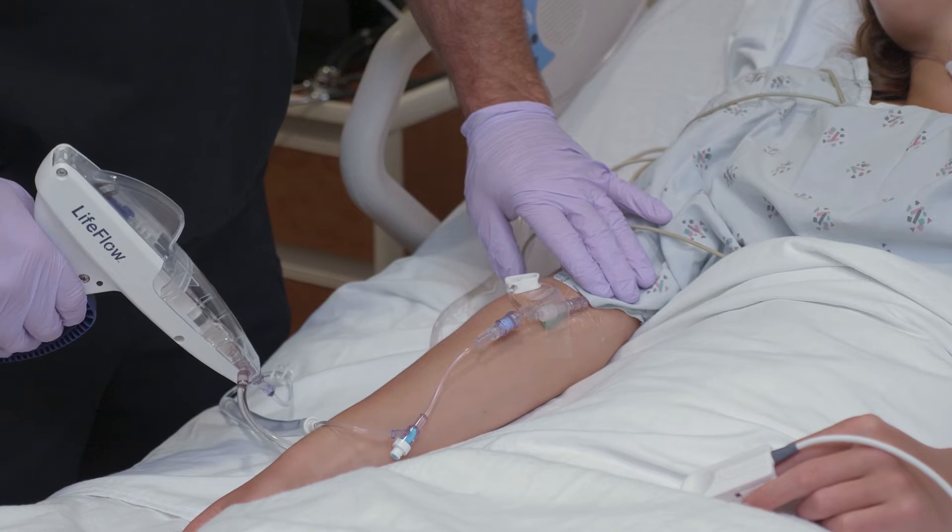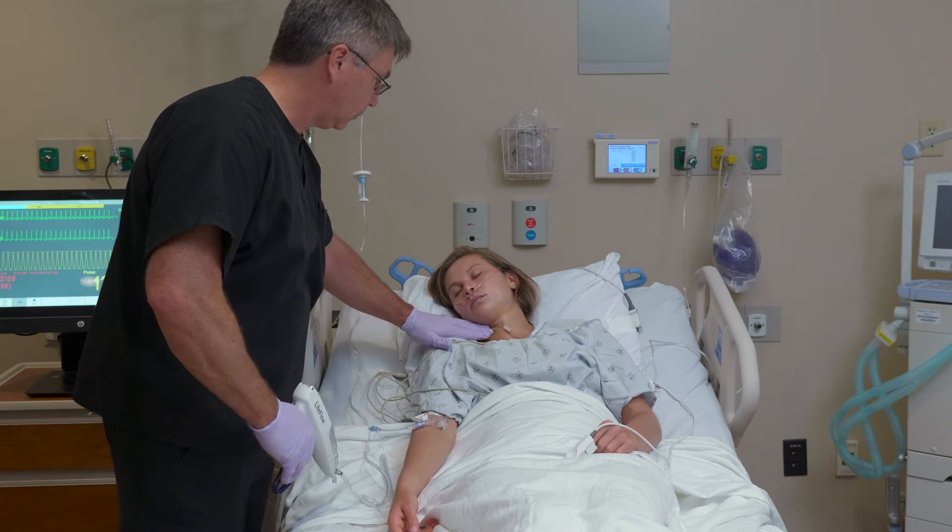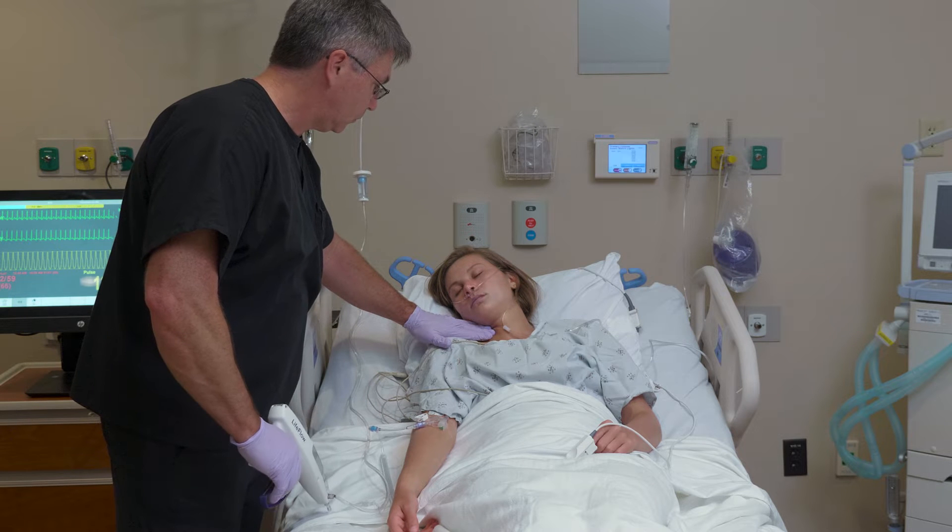Note that one hand remains free to monitor the infusion site, assess patient response to treatment, and address other patient care issues.